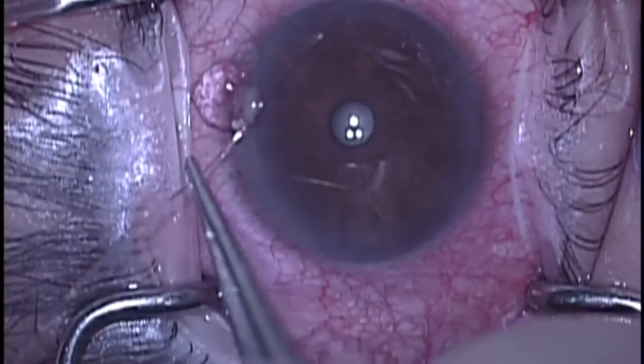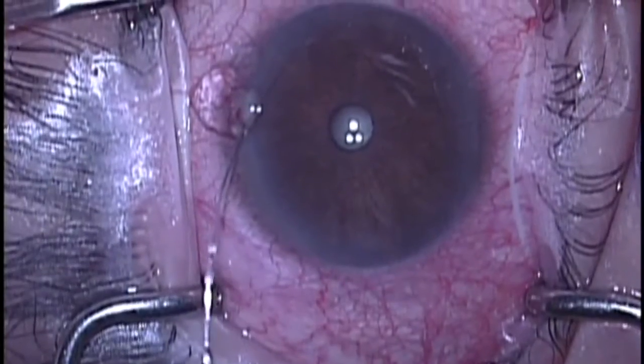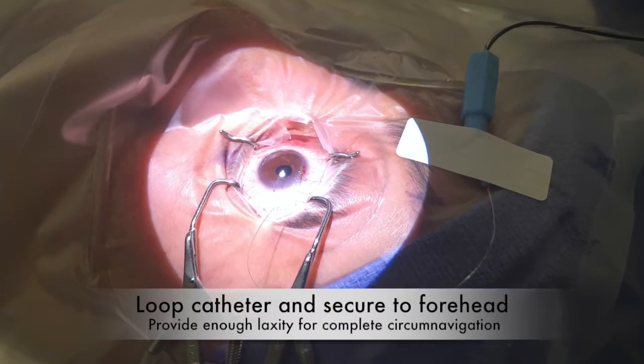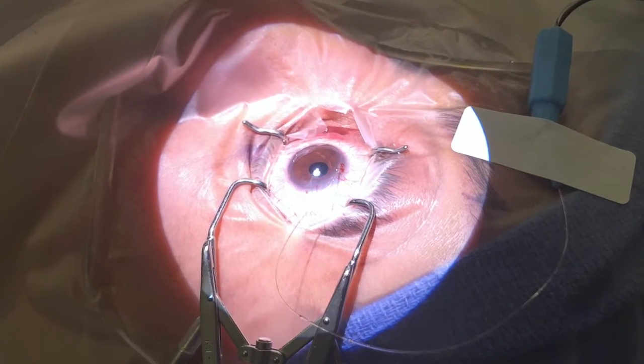Once the catheter is in the anterior chamber, one method of securing the catheter is to loop the catheter around and secure the port to the patient's forehead using a steri-strip.